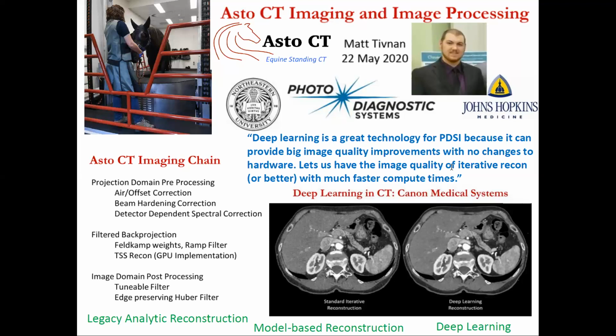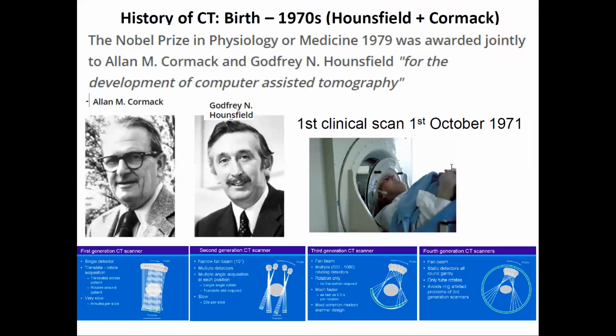The analytic reconstruction methods were around since the invention of CT. And the invention of CT came in the 1970s, and filtered back projection was not far behind. And that was what was classically used. All these things are developed given your compute limitations of the time, and essentially they worked well enough, potentially with filtered back projection and the improvement of the devices to get to third generation in a hurry.